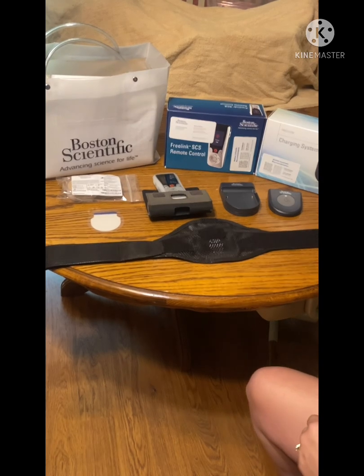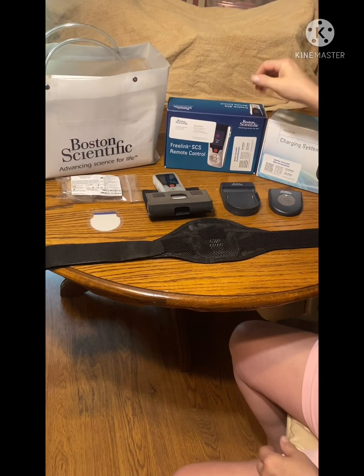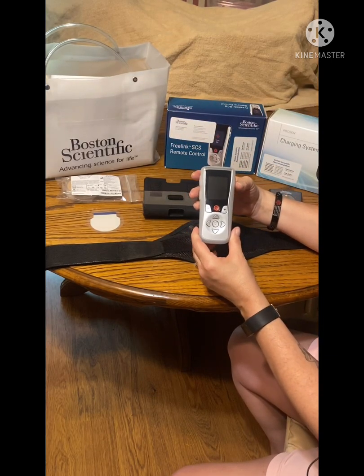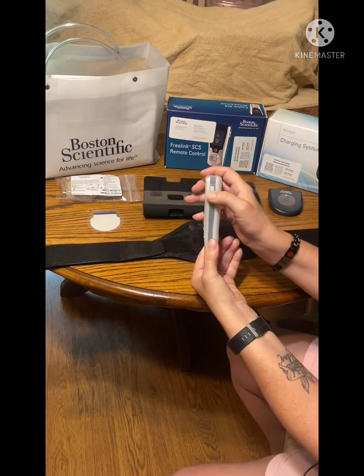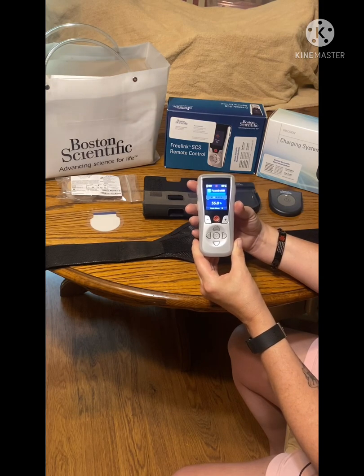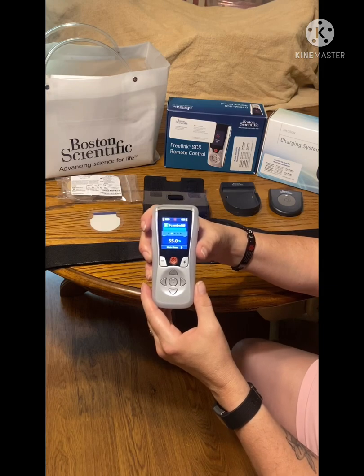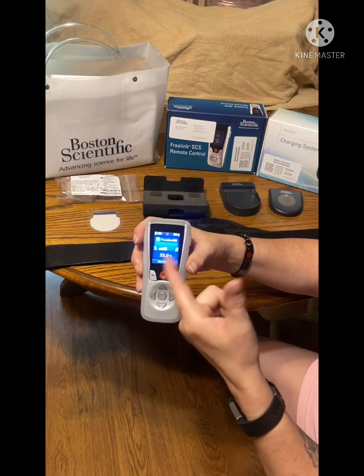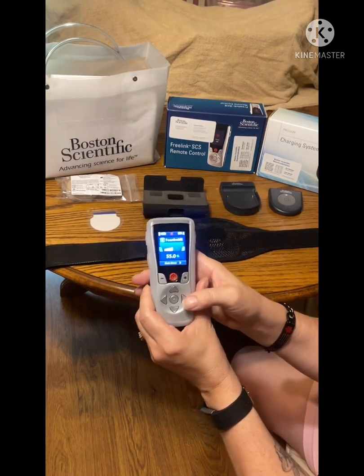First of all, the boxes that come with it. This is the remote that comes with it. You just push in this button on the side to get it to unlock, undo it, and it's thinking. When it gets done thinking it'll go to that — this is my eighth program.